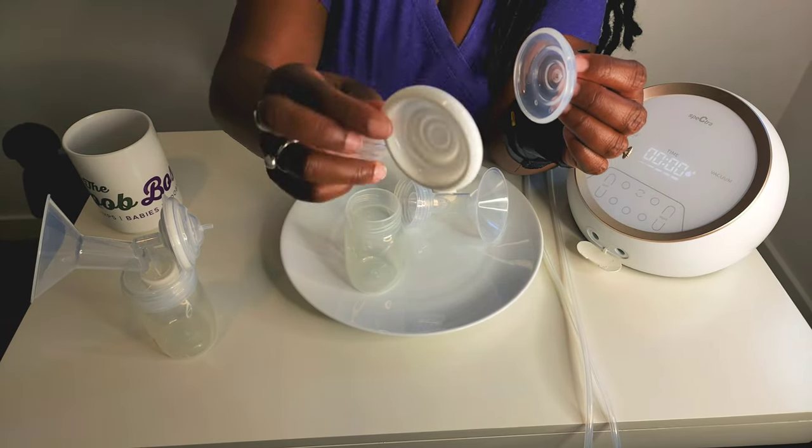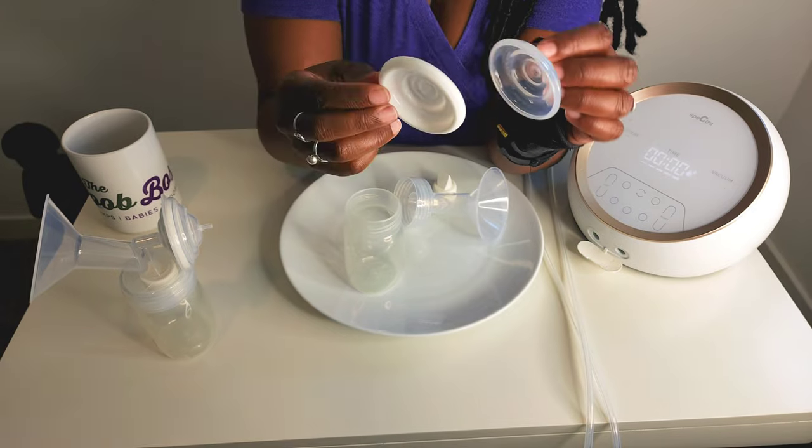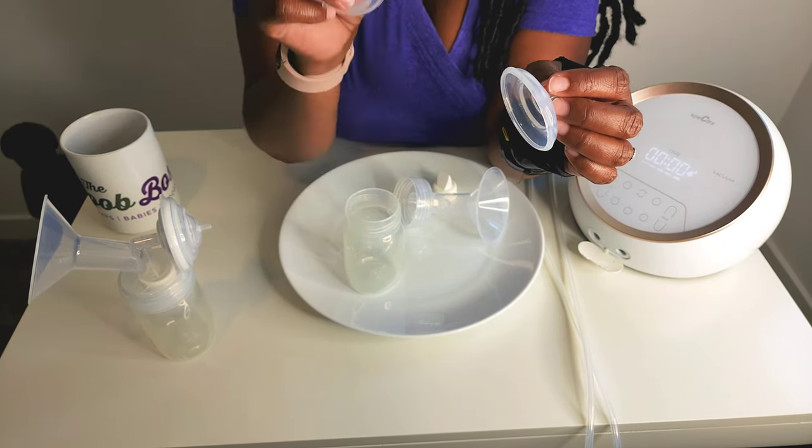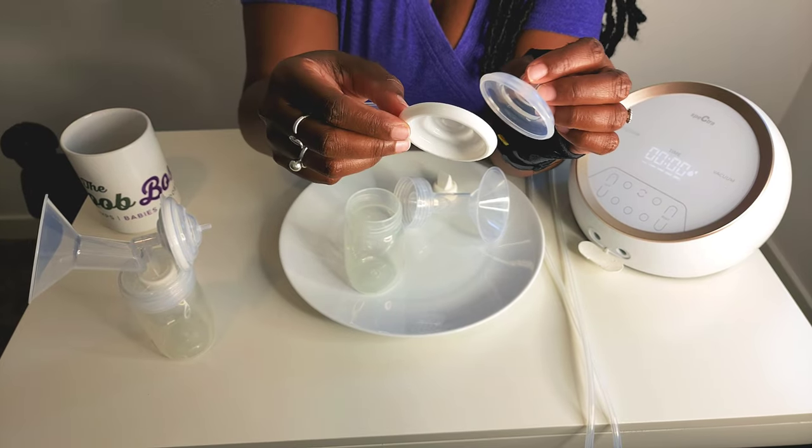Make sure that it doesn't have any holes or slits in it. So be careful when you're washing and sterilizing these. If you're using a bottle sterilizer, I use Baby Brezza, make sure you put it on the top and not the bottom, where it gets super, super hot.